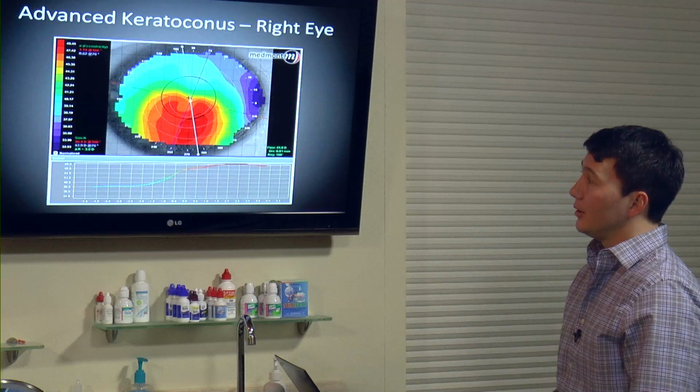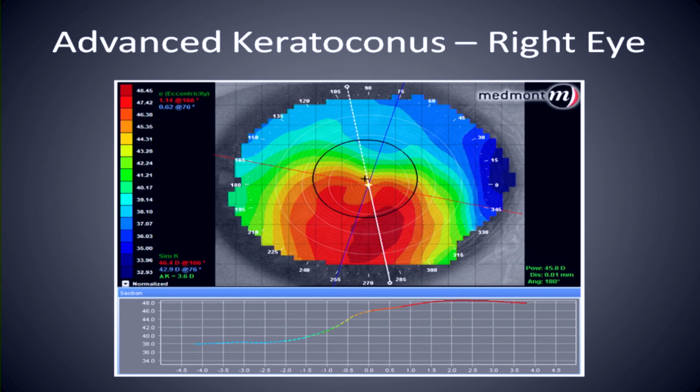Now here's a fairly advanced cone patient, and this is a patient that came into the school with a box full of lenses. They had 5 different cases, 10 lenses for their OU fit, and not one of them that they were comfortable in.